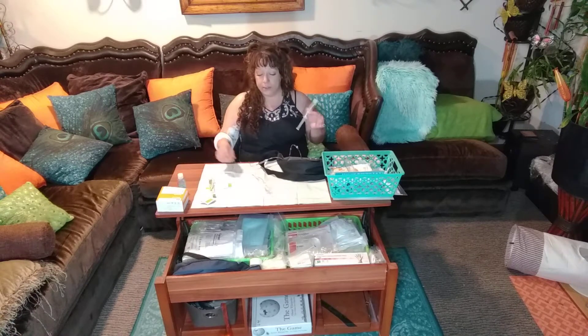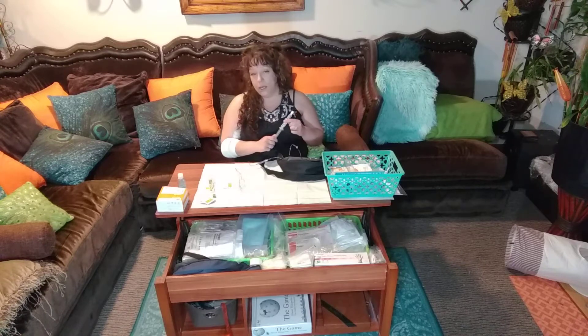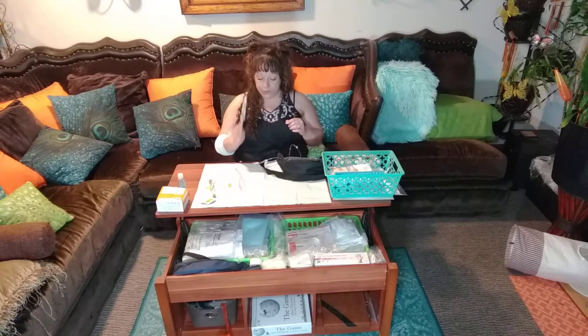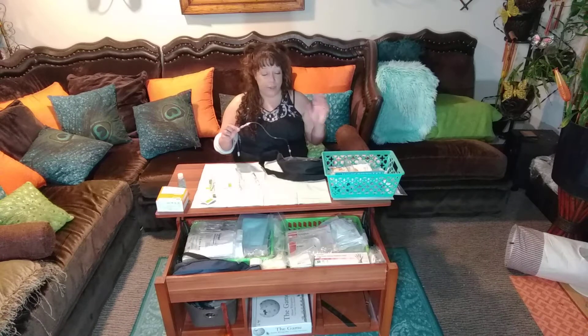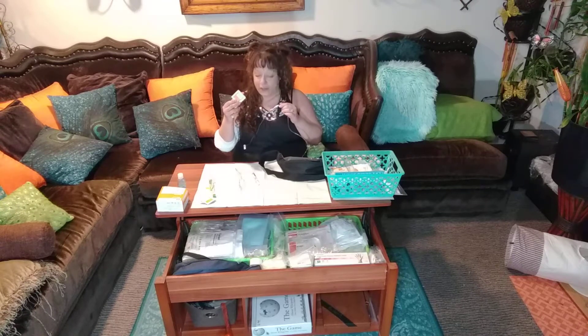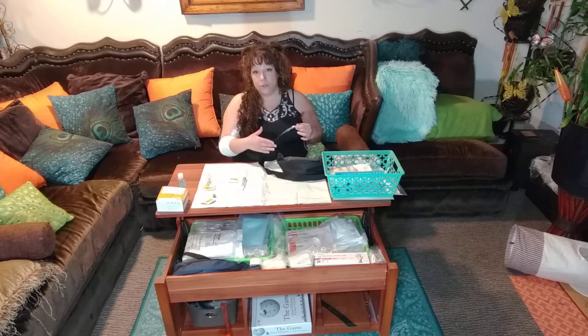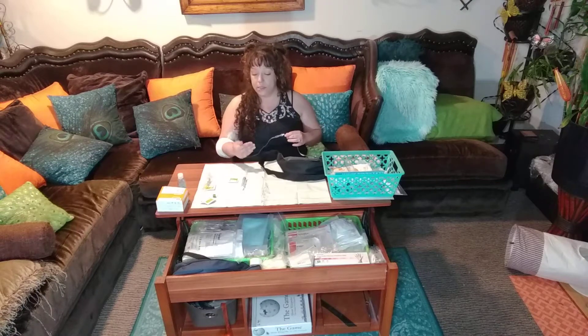For the unhooking stage, remember how I was saying you always need to flush your line with saline after you're done with your infusions — we're going to start by doing that. I bet you can all guess: we've got to clean the line. I want to make a note here — you see how I have my wipes underneath? This is so that when I'm going through this, I know what I've cleaned and when I didn't. That's what I was talking about in the beginning videos: organization is really key to success, especially when you're sick.